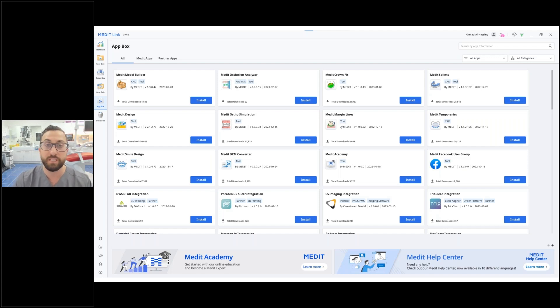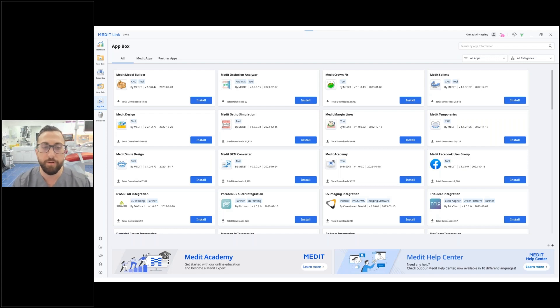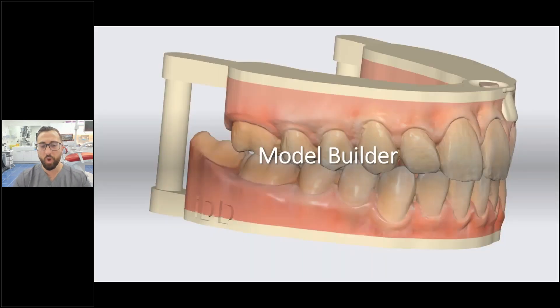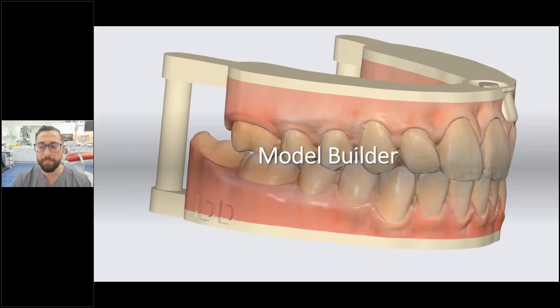I wanted to go over some of the key apps that really made a change in my practice. They've done everything from an occlusal analyzer, Medit Design, orthodontic simulation, Medit temporary splints, and now we have Clinic CAD.